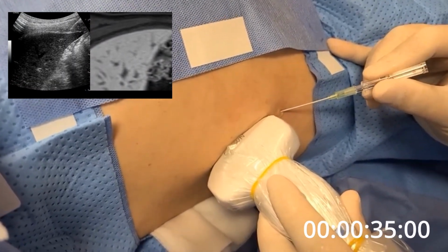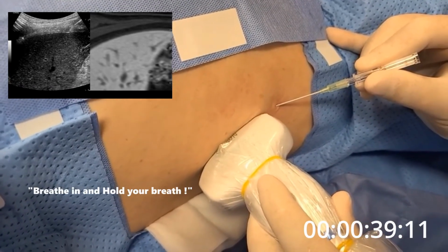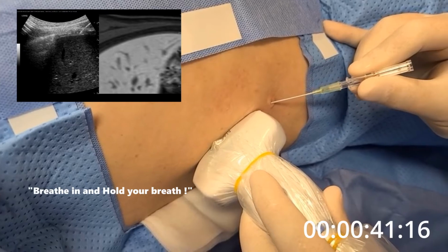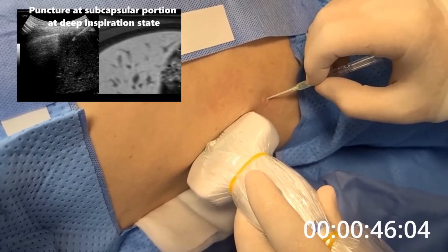After approaching the liver capsule like this, I instruct the patient to breathe in for downward displacement of the liver. At that time, I puncture just the subcapsular portion of the liver.